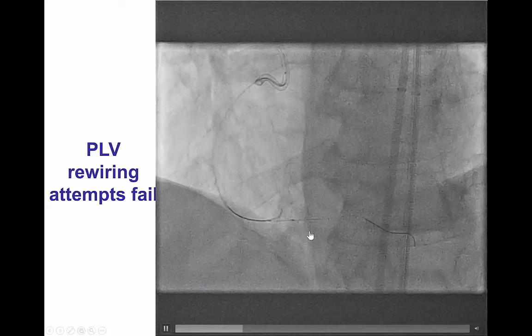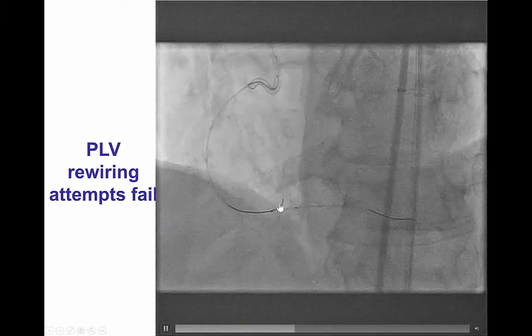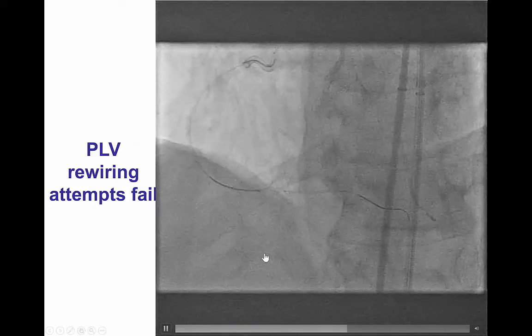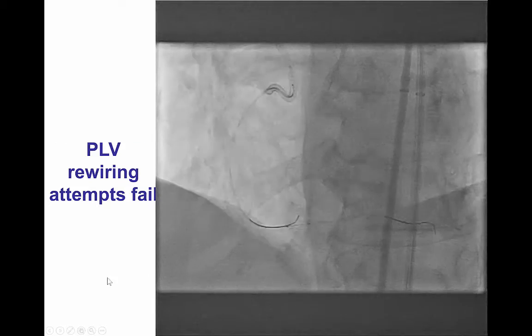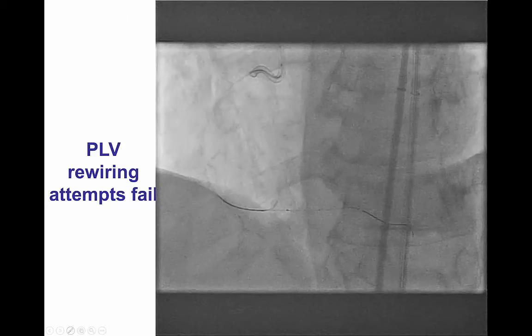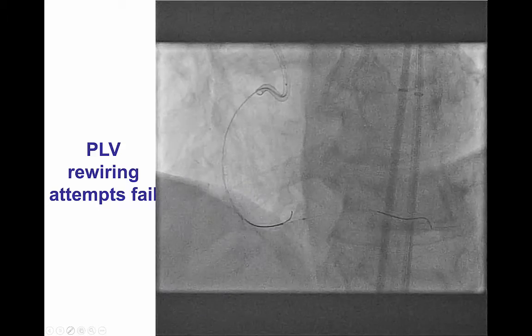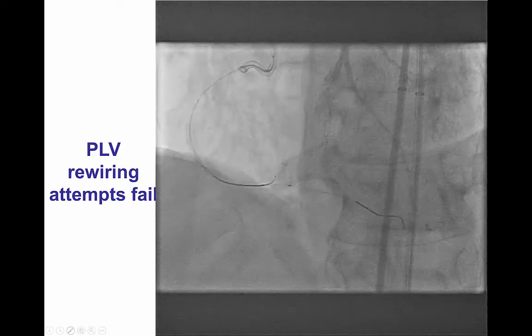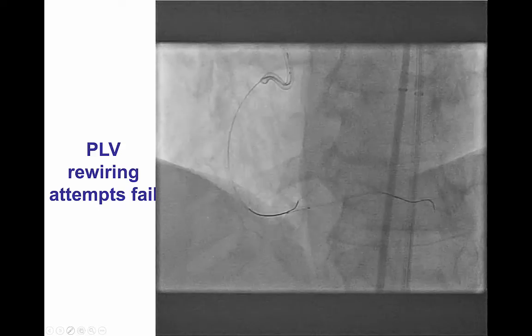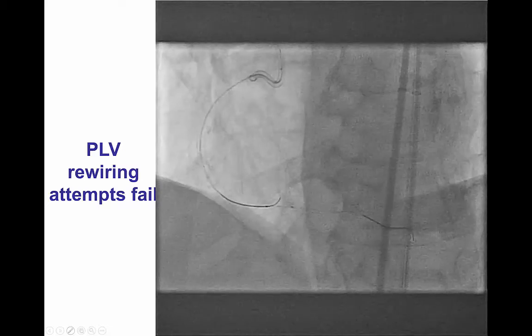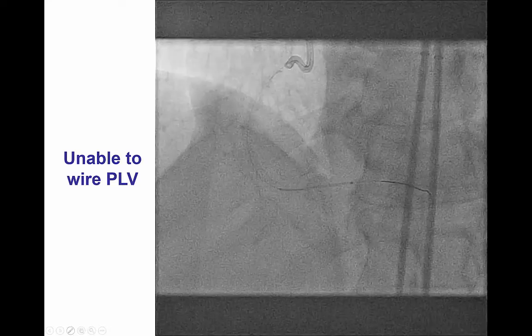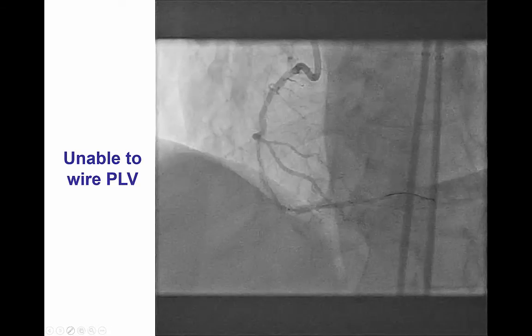However, we had significant difficulty advancing a guide wire into the posterolateral vessel. Several wires were tried, including PILOT-200 and Gaia-type wires, however could not cross.